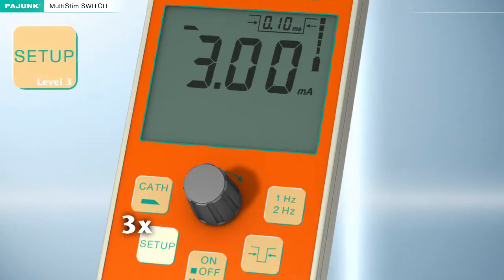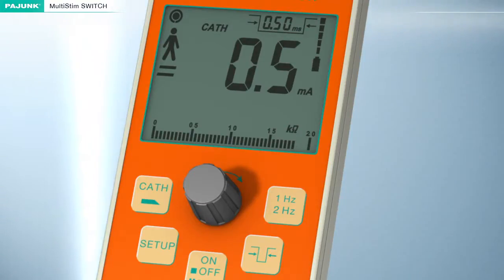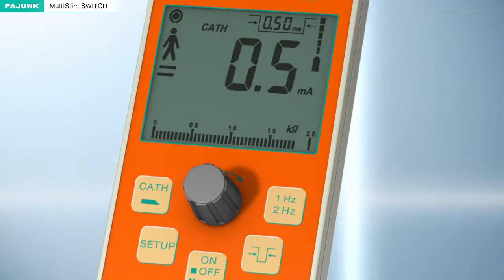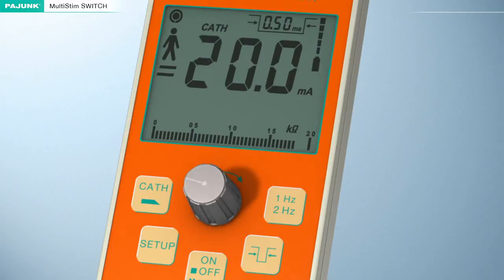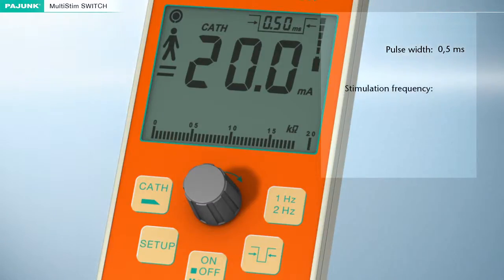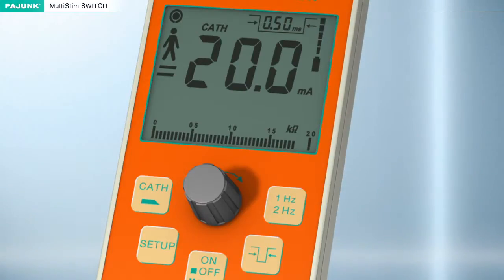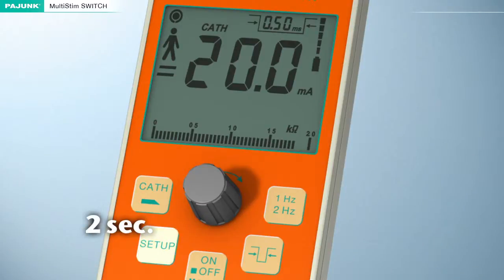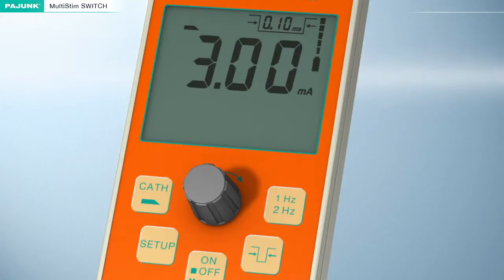Setup level 3: the catheter mode can be adjusted in level 3. Individual stimulation parameters differing from the manufacturer's default settings can be defined. The settings for the frequency and the impulse bandwidth must be adjusted in normal operation before pressing the Setup button for the first time. The intensity of the current can still be varied in the Setup function by turning this knob. The factory settings for the catheter mode are: pulse width 0.5 ms, stimulation frequency 1 Hz, stimulation current 2.0 mA. The Setup button must be pressed for at least 2 seconds to permanently store the values. A monitoring sound will be emitted upon successful storage, then the device will switch to pause mode automatically.